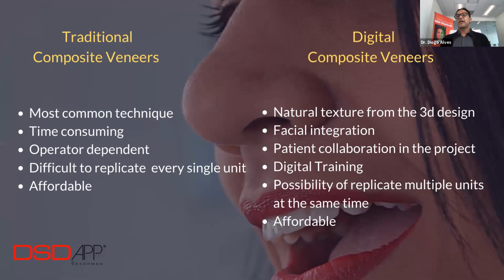So sometimes it's difficult to replicate every single unit. But on the other side, it's something that is very affordable to your patient.